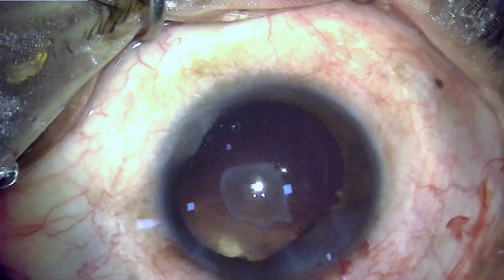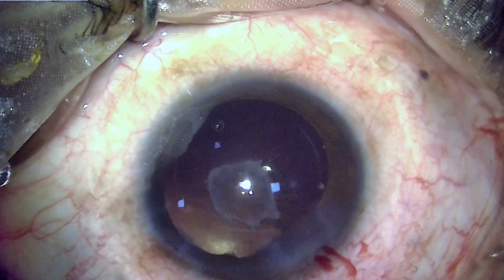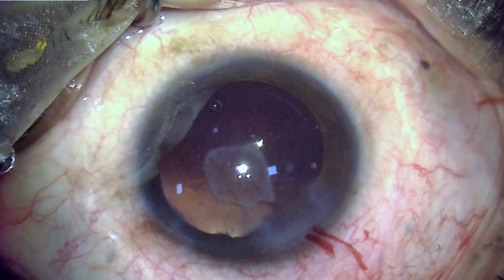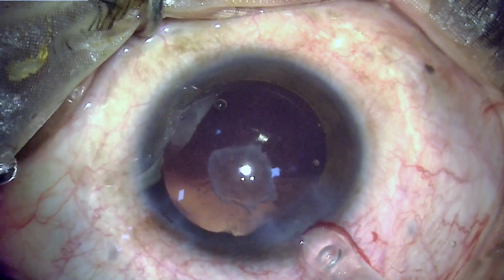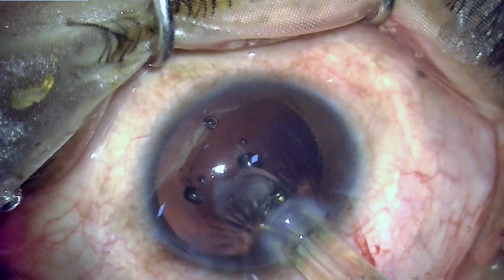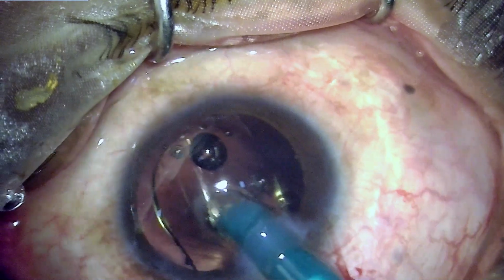So I decided to proceed with implantation of the IOL, which is a hydrophobic monofocal IOL, and later on we can take care of this plaque once the cataract surgery has healed and the haptic has been stabilized. We can use YAG laser to detach this plaque and let it wander into the vitreous cavity. That seems to be a much safer option compared to a situation where you have a compromise in the posterior capsule while you have silicone oil in the posterior segment.